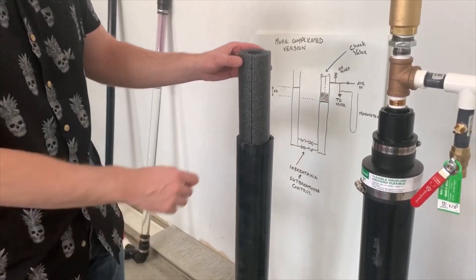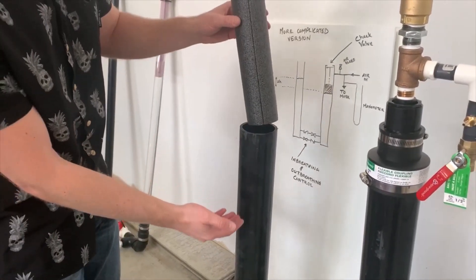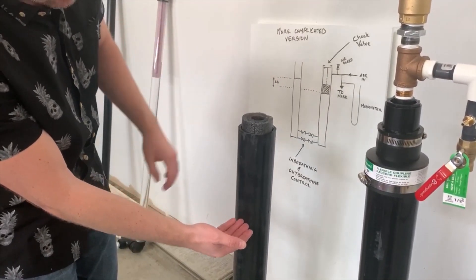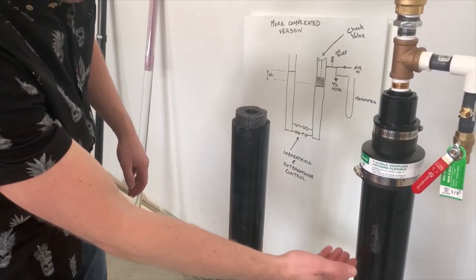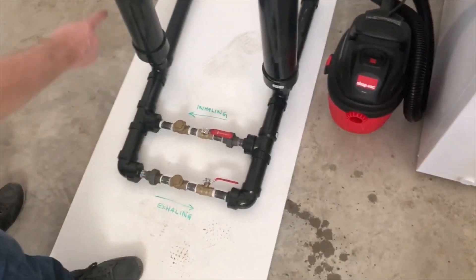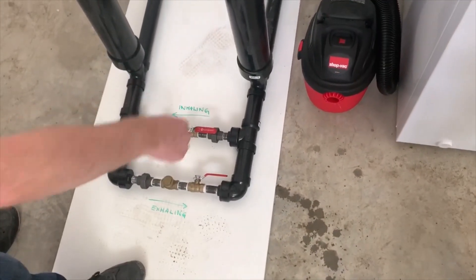On this side of the U-tube is just a piece of foam to demonstrate where the water level is in the system. At rest, the water level is right about there on both sides of the U-tube. Down here you can see the check valves and ball valves which allow you to control the flow in either direction.